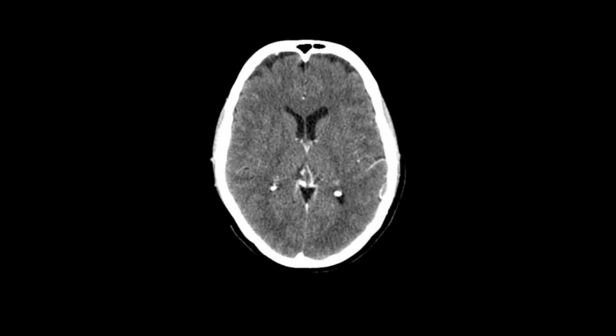First of all, the contrast material enhances on CT imaging, which means it's bright, hyperdense. We're gonna talk about density later. In a normal brain, contrast material does not go into the brain, meaning that it's in the margins of the image. It's an extra-axial enhancement, not intra-axial. I'm not going to talk about this part a lot in this video because it's a little bit more complex, but basically, as long as the blood-brain barrier is intact, the contrast does not get into the brain. It's on the periphery of the brain.